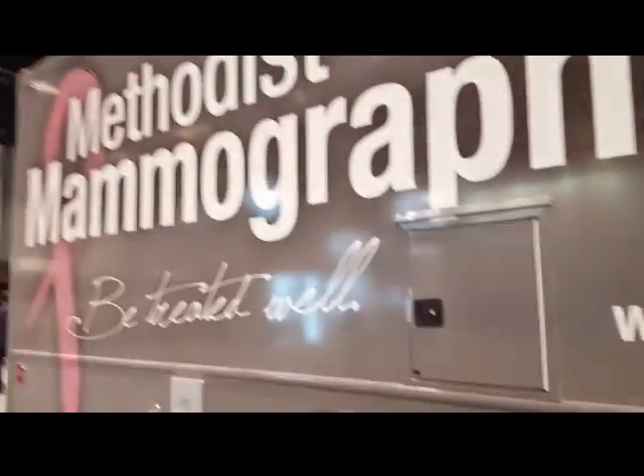I've always wanted to see what one of these things looks like on the inside. I'm sure the other MAMO techs would be interested in that too.